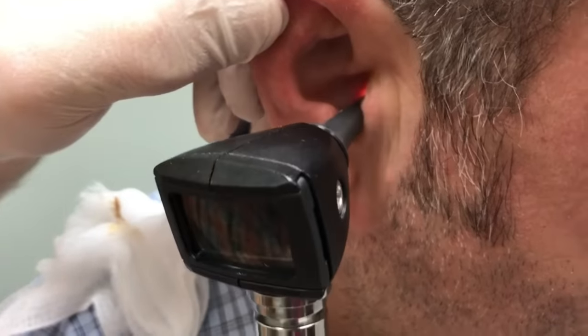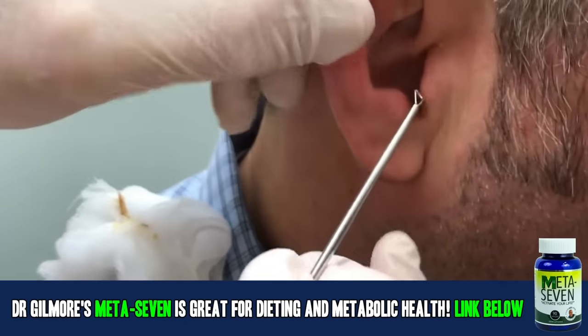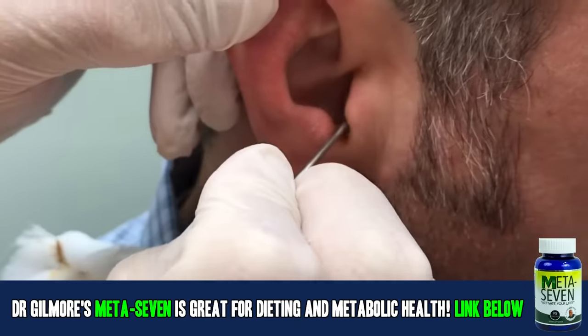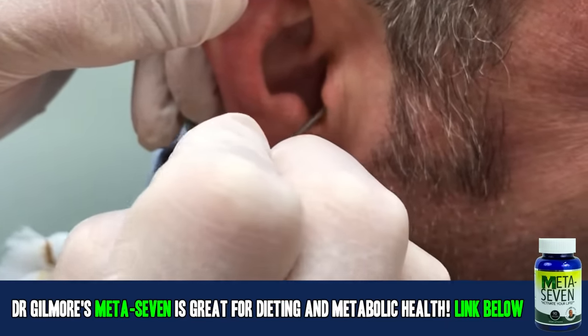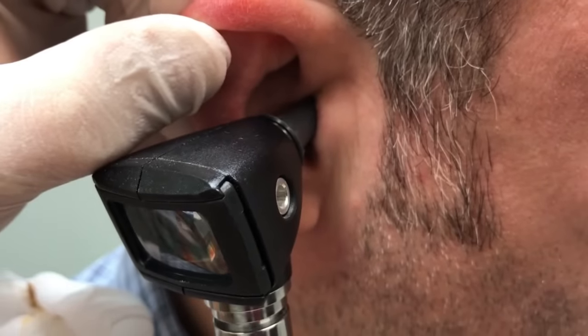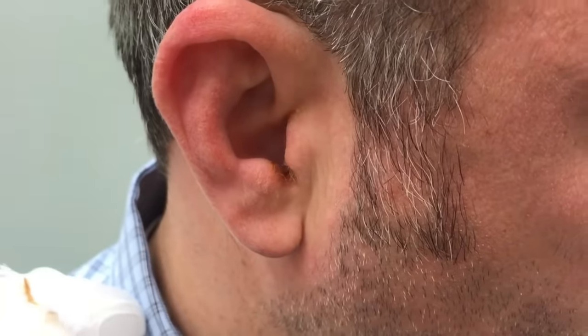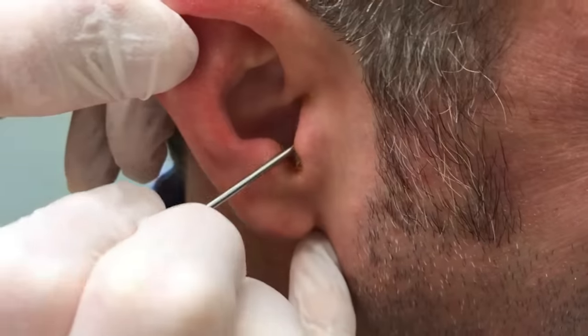You alright? It went good. Put some water in there. I'd have just a wee bit more — now don't go anywhere. It should feel a little bit odd, but it shouldn't hurt. You've still got a great deal in there, so we're going to try one more time right over here.